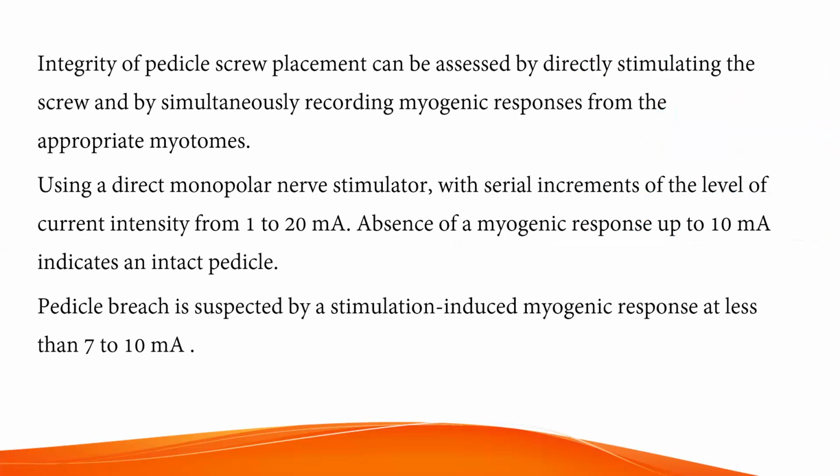The integrity of pedicle screw placement should be assessed by directly stimulating the pedicle screw while simultaneously recording the myogenic response from the appropriate myotomes. Using a direct monopolar nerve stimulator, a series of incrementing levels of current is given.